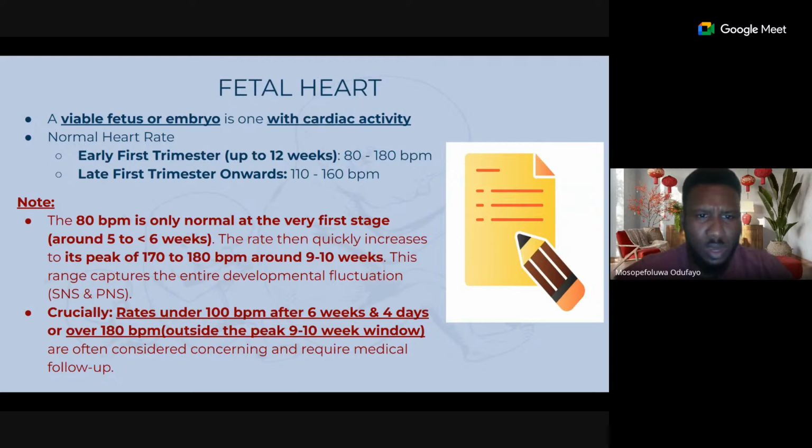And in places where we cannot see the heart rate, then viability is queried. And then that combined with some other factors that we would eventually learn later, we can determine whether we might just need to give some time before we see the heartbeat, or at this current moment, that baby is not alive anymore.